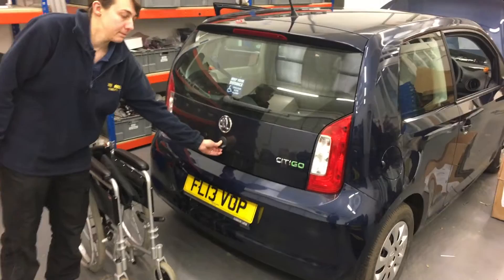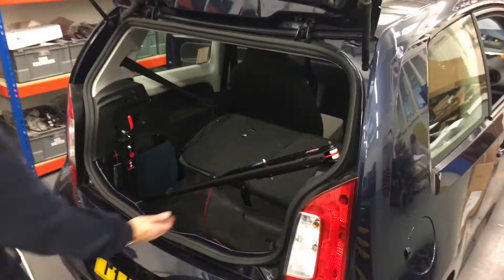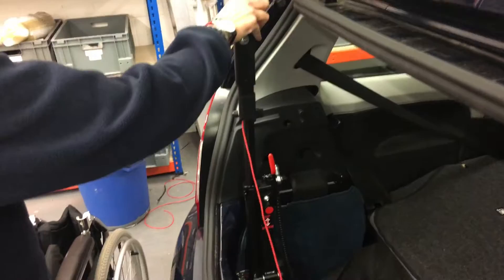This is a video of a Brigade 40 kilogram two-way hoist loading a manual wheelchair into a two-door Skoda Citigo. Amy's just going to take us through all the steps in the process.